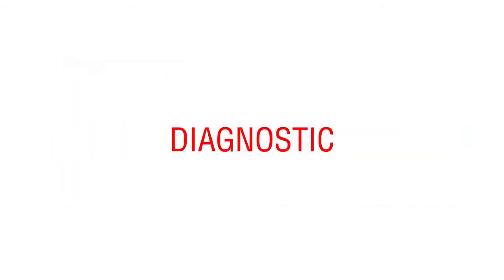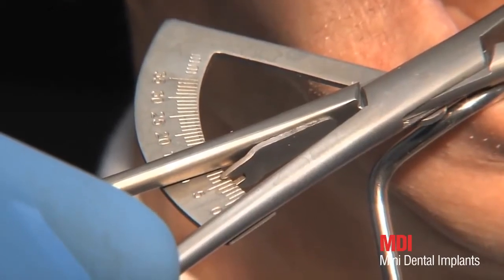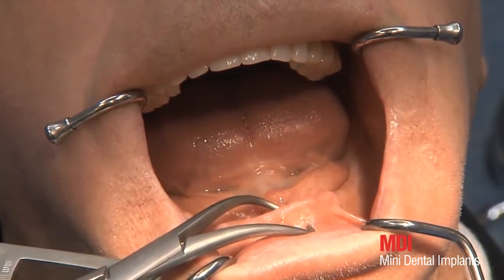A bone mapping caliper can be used to determine the bone thickness. A minimum thickness of 4 mm is necessary to ensure that the implant is surrounded by a minimum of 1 mm of bone.